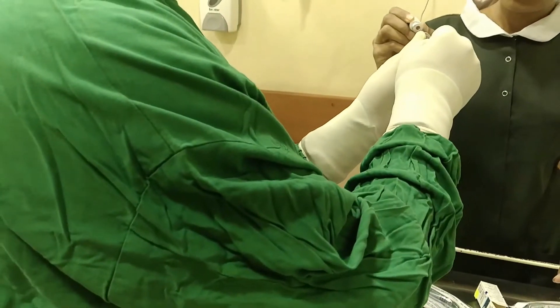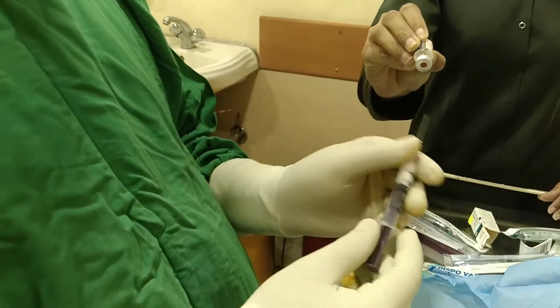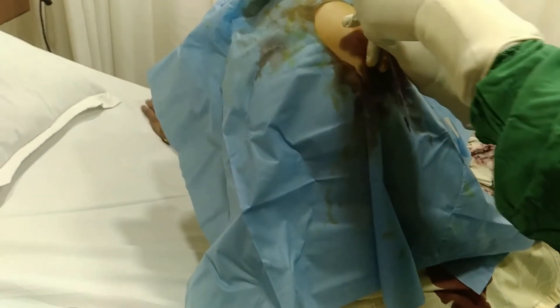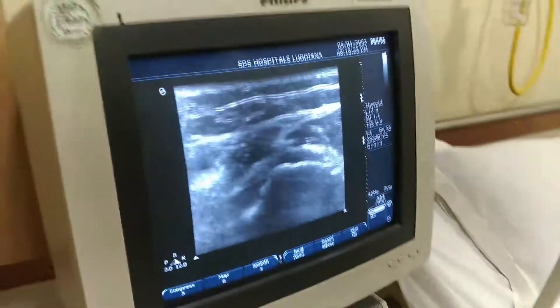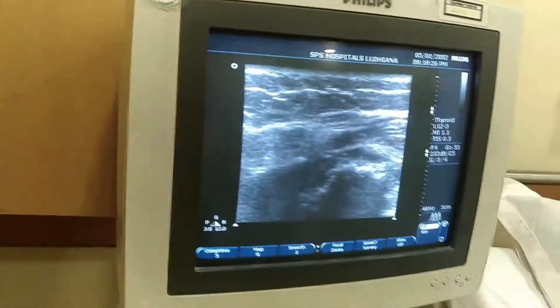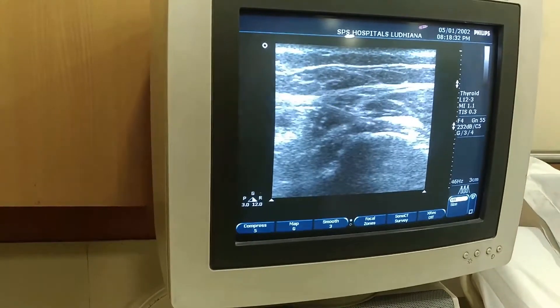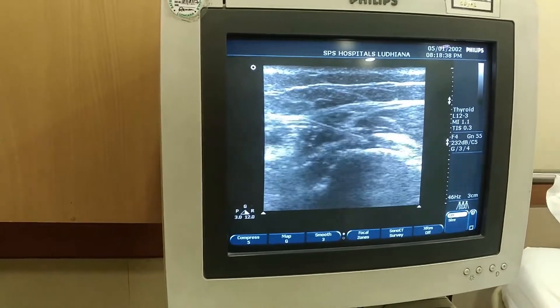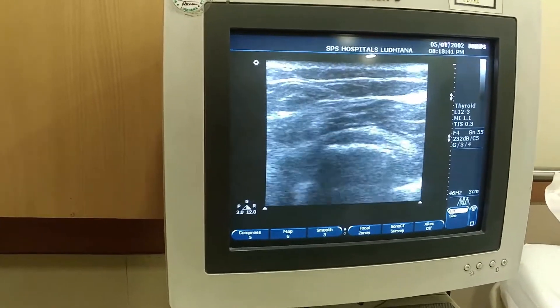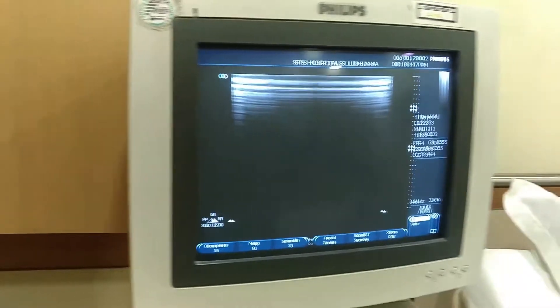Detect the 40 ml mark. So very nicely depicted. Now what we will do is change the direction.